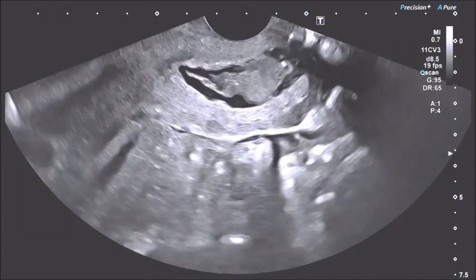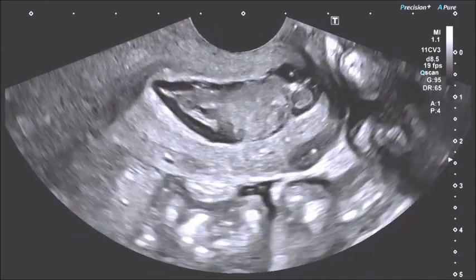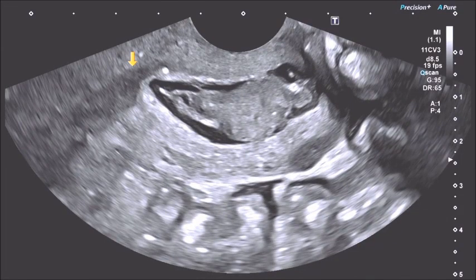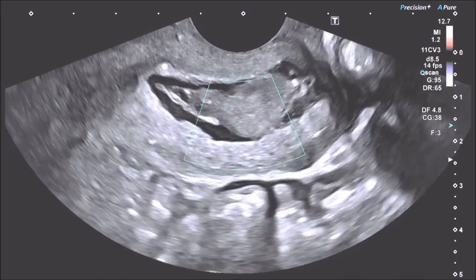Following the initial phase of the procedure, the examination then continues with a transvaginal approach, which is performed after the patient has completely emptied her bladder, a necessary step to ensure the clearest possible imaging. The patient being examined is a 44-year-old woman who is currently in the perimenopausal period of her life. The reason for this specific approach is that it allows for a significantly more detailed and closer look at the specific dimensions and size of the cervical neoplasm, which is an abnormal growth of tissue on the cervix.